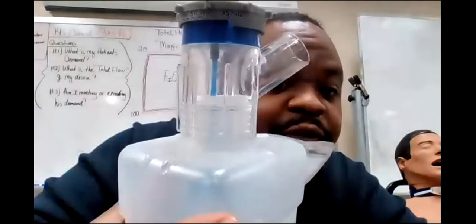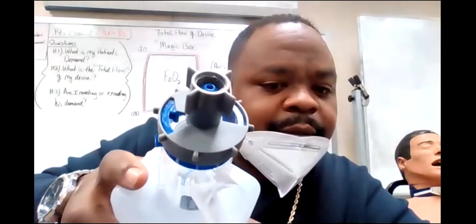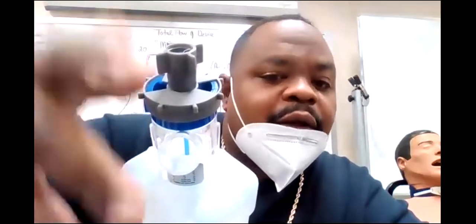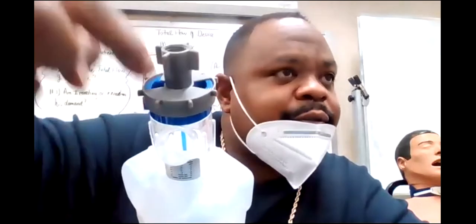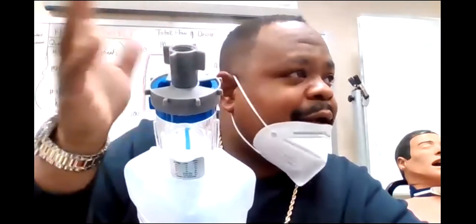Okay, 35, which is a low FiO2. Now look at the windows. See how open they are? See that? I'm looking almost right down in there. So the lower the FiO2, the more flow you're going to have because you're pulling in all of that outside air into these ports. But if I need more FiO2, then I've got to cut some of that outside air out.